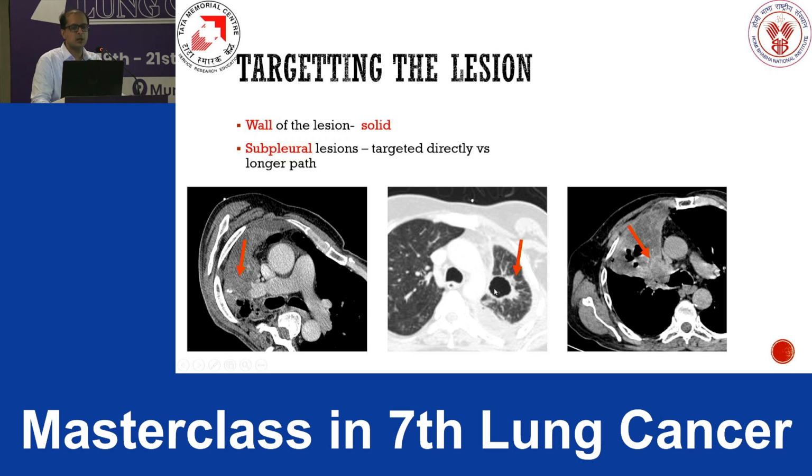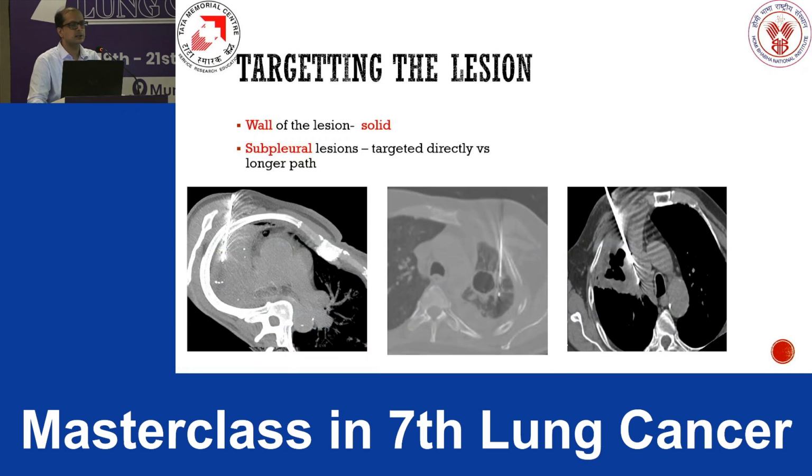So this was a patient after treatment, and what do we see? There was a cystic area and some solid residual area which had newly come up after chemotherapy, and this is the central lesion, as I mentioned earlier. So these were all targeted, and were proven to be malignancy.